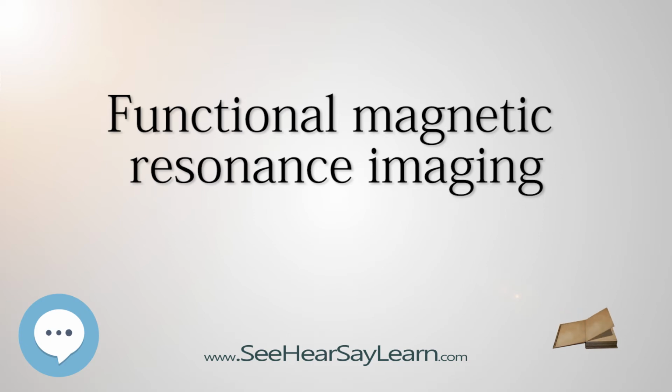Tumors and lesions can change the blood flow in ways not related to neural activity, masking the neural HDR. Drugs such as antihistamines and even caffeine can affect HDR. Some patients may be suffering from disorders such as compulsive lying, which makes certain studies impossible. It is harder for those with clinical problems to stay still for long. Using head restraints or bite bars may injure epileptics who have a seizure inside the scanner. Bite bars may also discomfort those with dental prostheses.